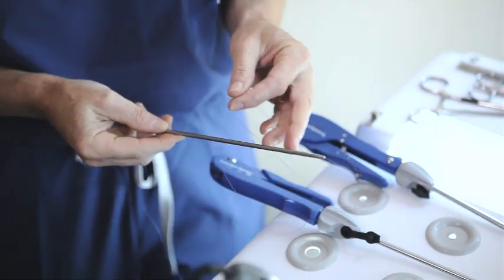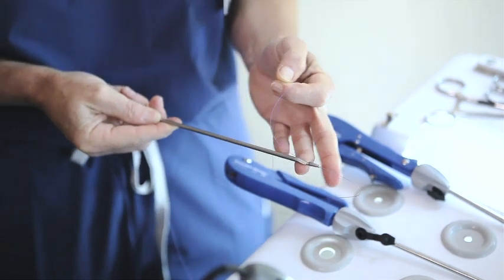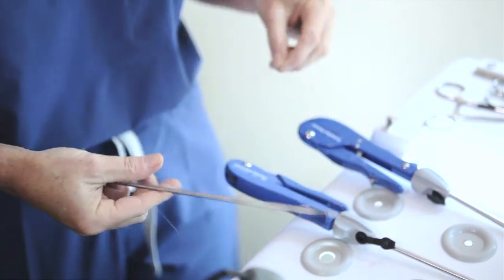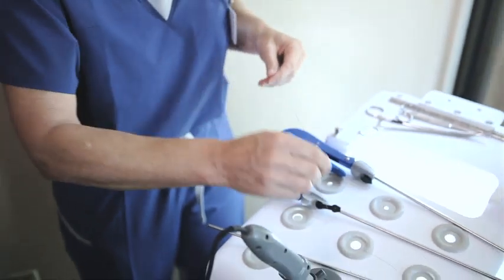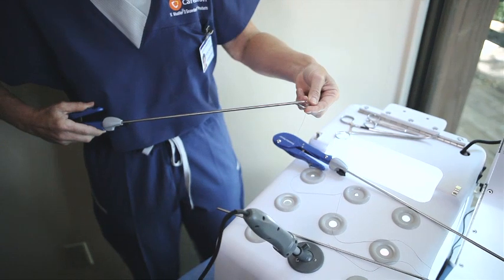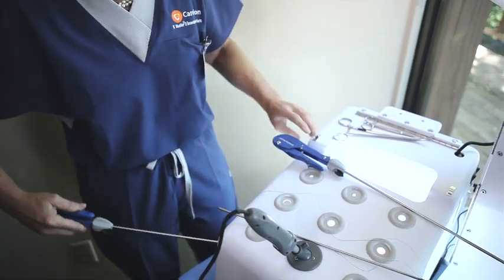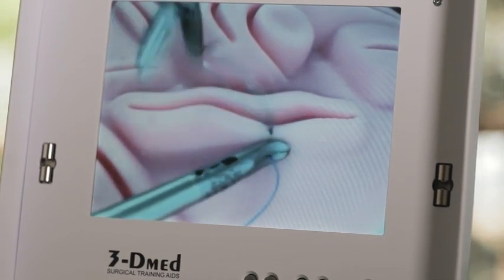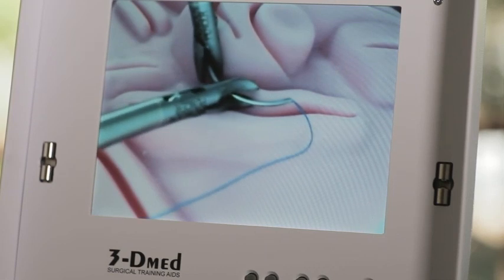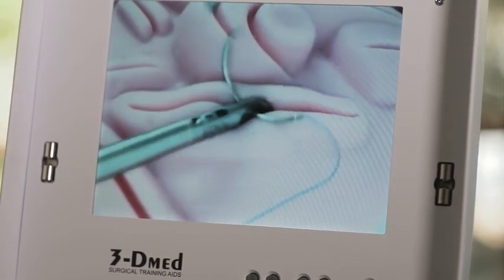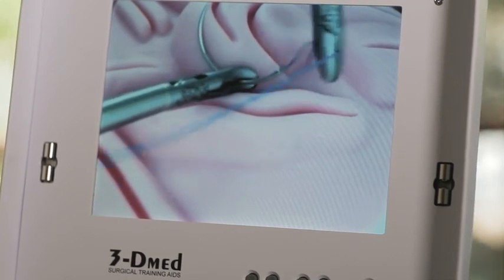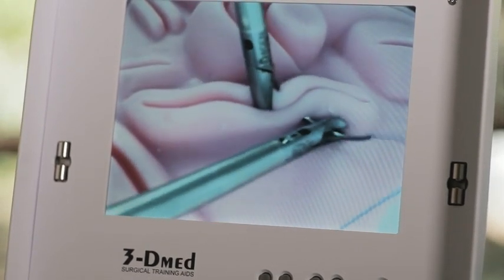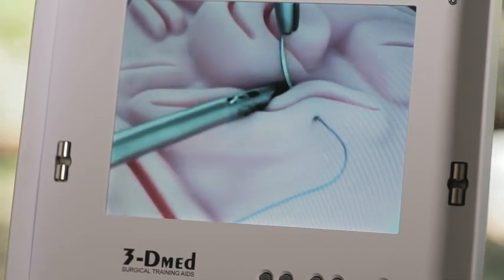To demonstrate extracorporeal knot tying, we're going to start with our extracorporeal knot pusher pre-loaded at the end of our suture. We use the full length of the CT1 suture. I'll set this aside as I take my suture and needle and pass it through the tissue, into the trocar, and pass our stitch. I'm going to grasp it in the sweet spot. I could either use the tissue to orient me or perfect it by pulling the suture.